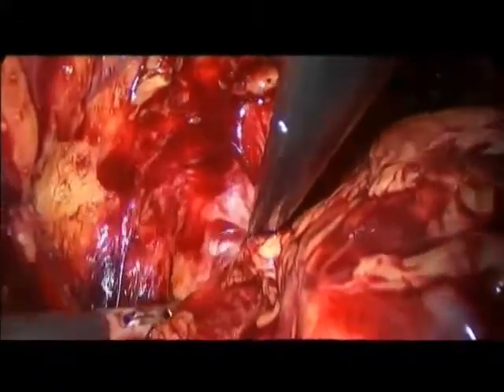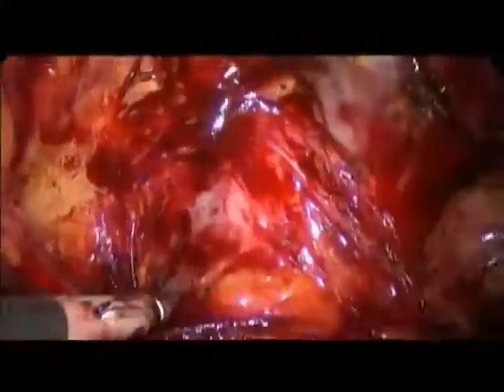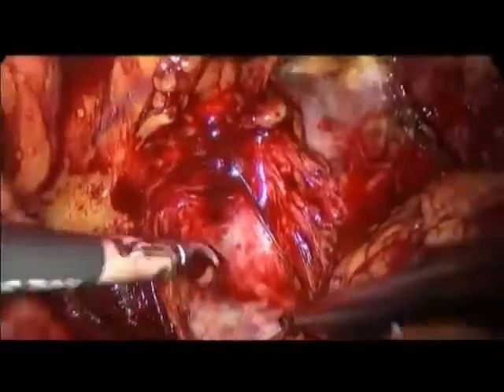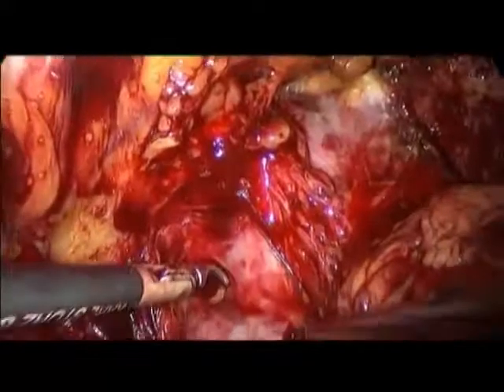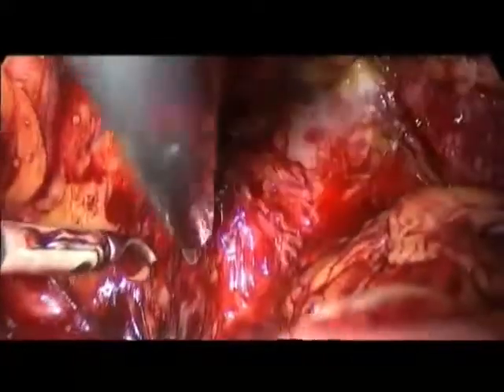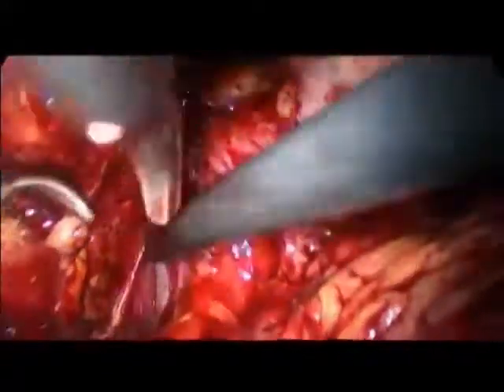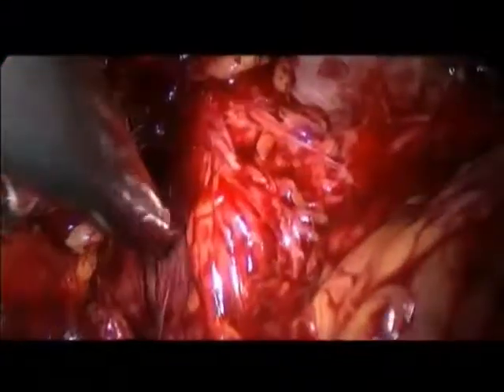So in my conventional approach, I prefer now to open the endopelvic fascia to have a clear view on the lateral aspect of the prostate. And this can be done in a combination of sharp and blunt maneuvers. You see already large veins of the lateral aspect of the prostate covered by the prostatic fascia.